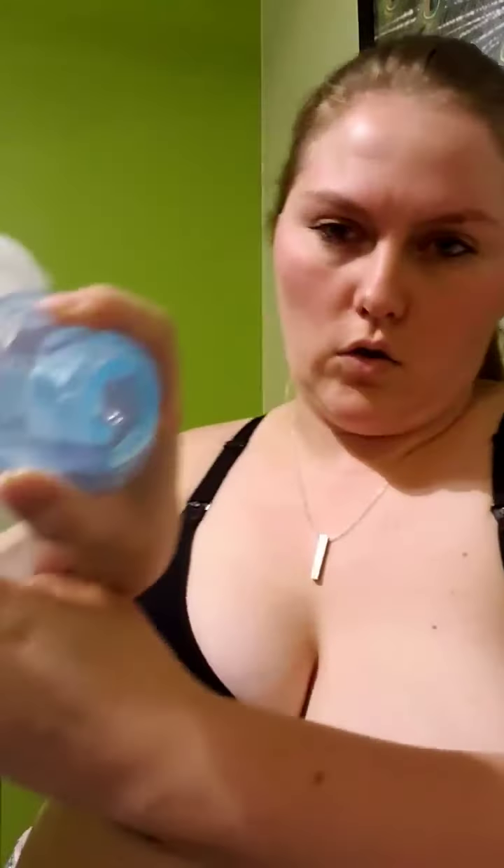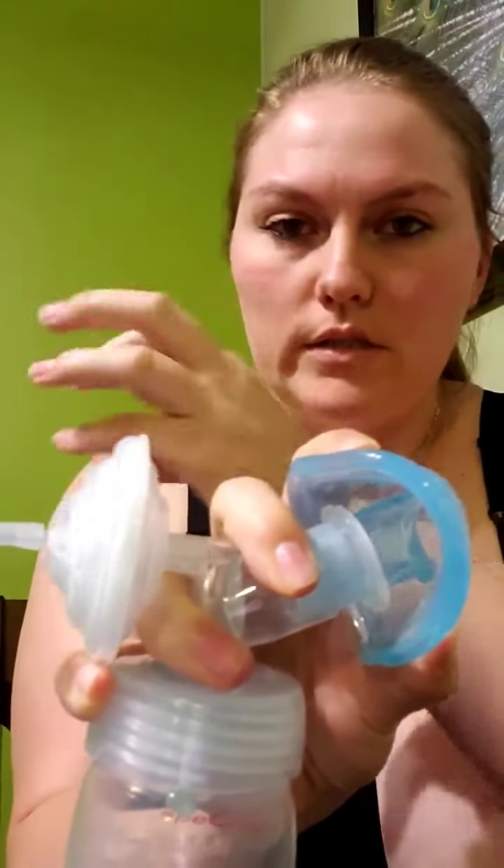What you want to do is take your two hands and flip this flange backwards to make an O shape. I hold it like this with my two fingers to keep it flipped back. Watch your backflow protector — when the pump suctions, it's going to pull the backflow towards the back, so that's important to pay attention to when you're doing this.